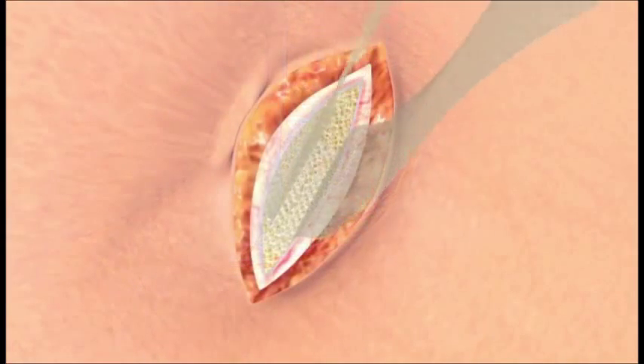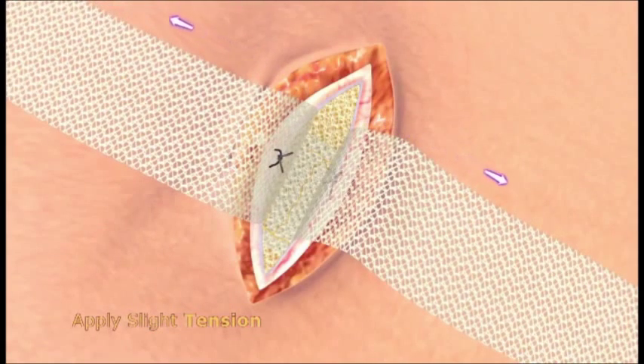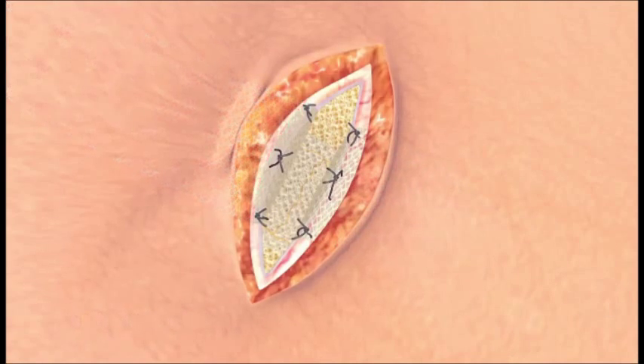With slight tension perpendicular to the device, suture the fixation straps and or the anterior portion of the mesh to the margins of the defect. Trim and remove the excess length of the fixation strap material after device fixation and close the wound using standard surgical techniques.